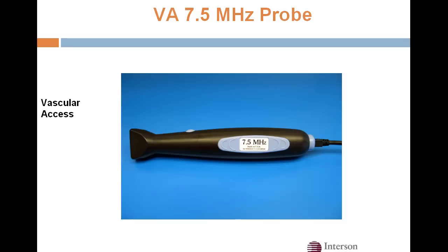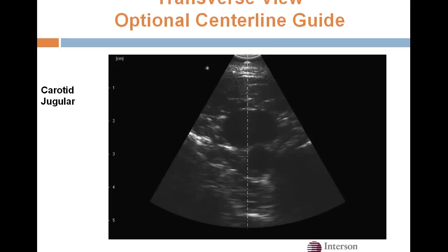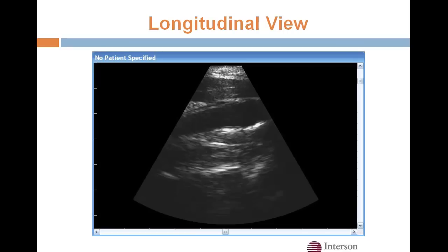Here's our vascular access probe. The center frequency is 7.5 MHz, but we can pulse up to 24 MHz for even higher resolution. Here's a transverse view of the jugular and carotid — we have an optional center line you can superimpose, which some people like for doing vascular access. And here's a longitudinal view of the same vessels.